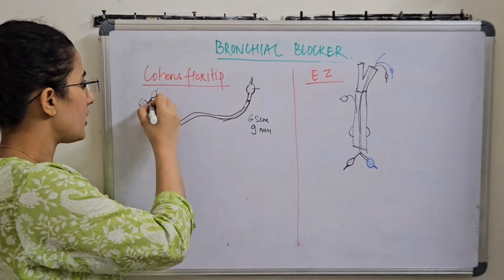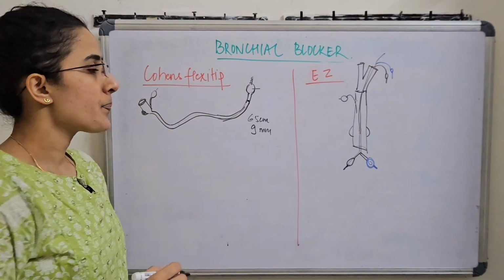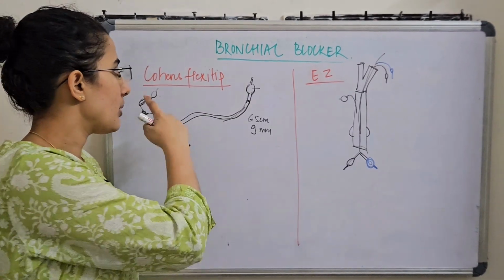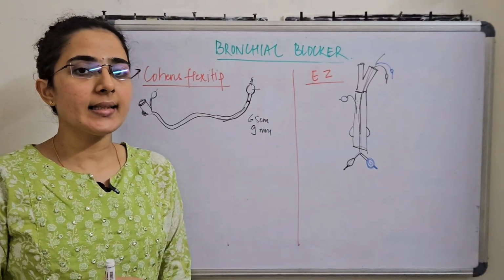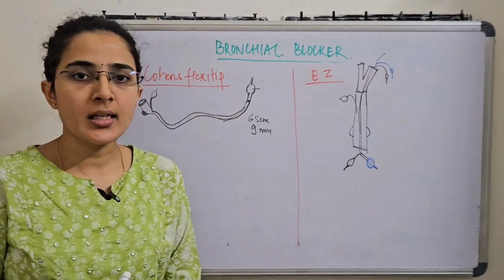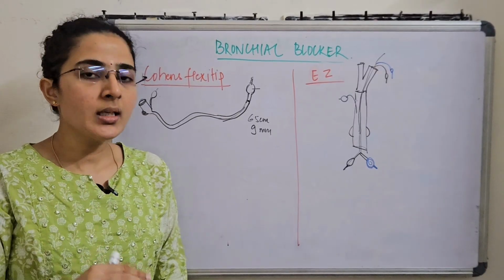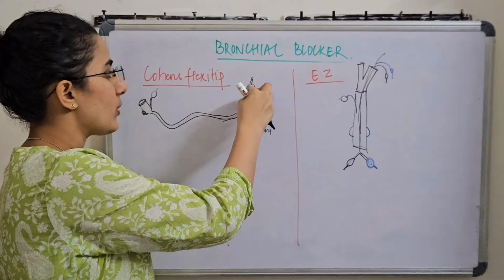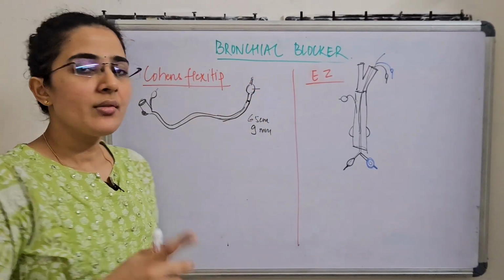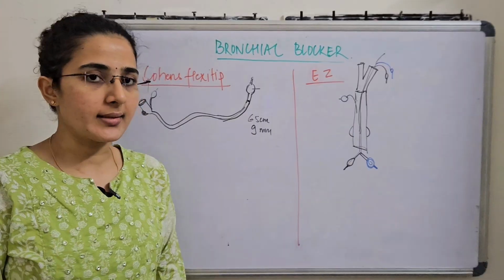On the proximal end, we had what we call a wheel turning device. The entire flexi tip could be angled to more than 90 degrees using this wheel turning device. Once we insert it through the single lumen tube, we can turn the tip of the Cohen's flexi tip to more than 90 degrees and position it in place.